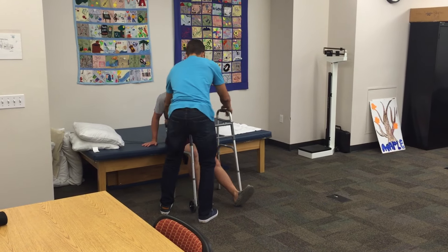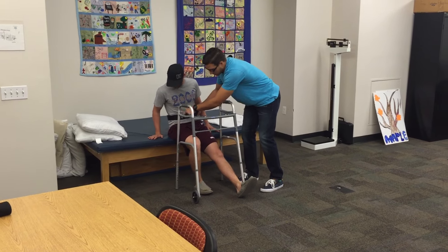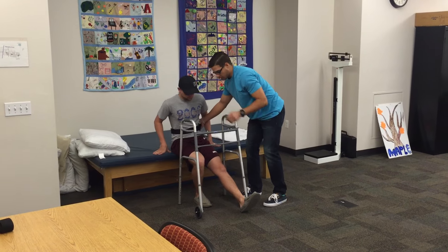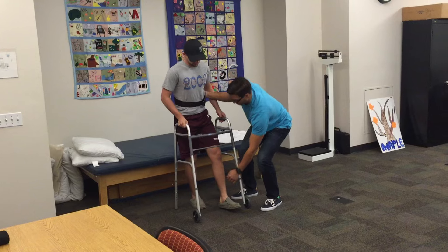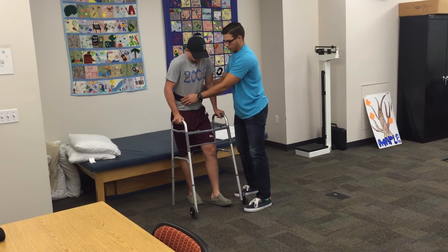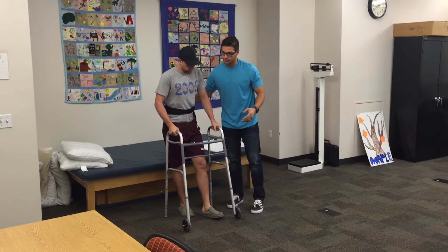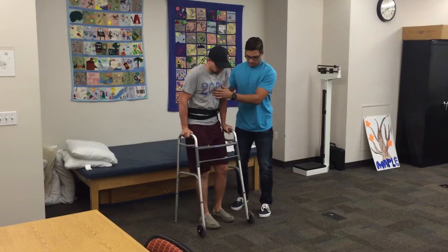So what I want you to do — come on this side. I'm going to put you leaning towards that way, put all your weight in there, push up through here, and then push up through this hand. On the count of three: one, two, three. Perfect. All right, how are you feeling? Not too bad. Okay. Now let's do the sequencing — you remember? It's the walker, the bad leg, and then the good leg. There we go. Perfect.